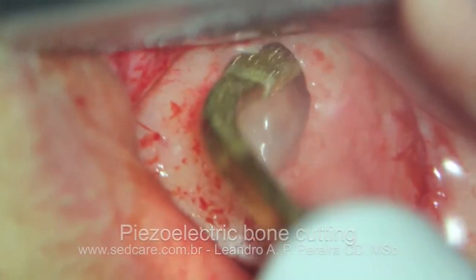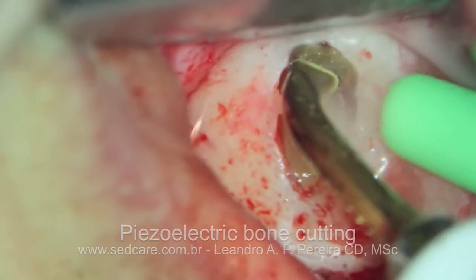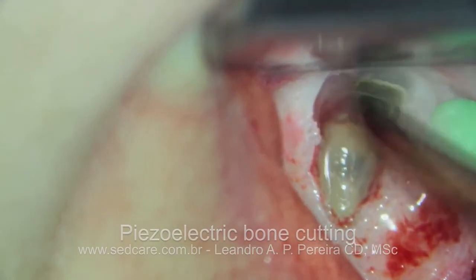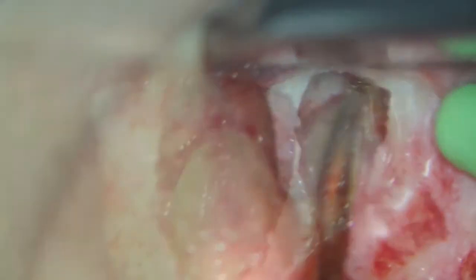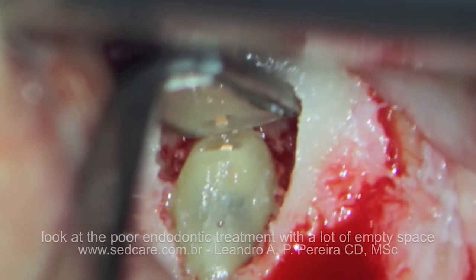Piezoelectric surgery is another great application for ultrasonics. This video was made by Leandro Pereira. Thanks to Leandro for providing me with it. For apicectomy, it is great to use. Minimal invasive cutting can be made with the help of special instruments or tips that are coated.